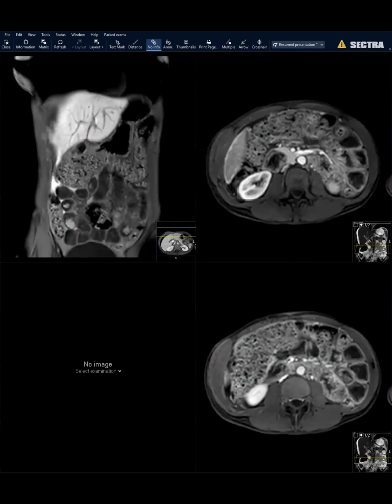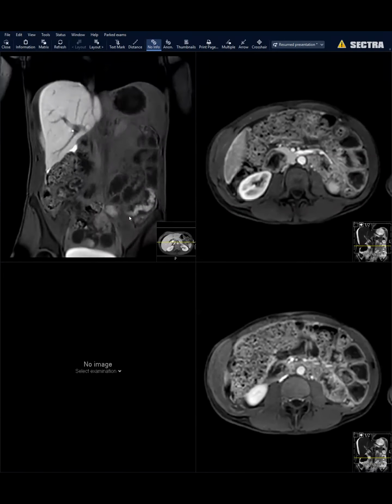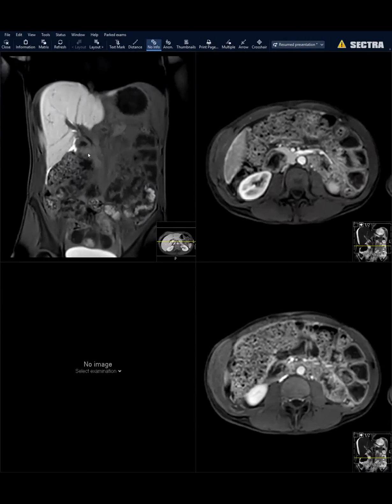So with Eovist, it's better than HIDA because you can localize where the leak is coming from. So if they do an endoscopic intervention, they have a pinpoint place, rather than HIDA, which just tells you it's leaking, but doesn't tell you where it's leaking from.